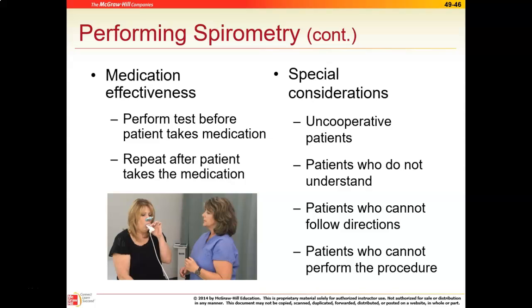Because even if they understand, sometimes it's difficult to perform. And so you can have uncooperative patients, whether intentionally or unintentionally uncooperative. They may not understand what you're talking about. They might struggle to follow directions, and they may be just unable to perform the procedure. So the more coaching, the more communication, the more direction you give and demonstration will help ensure that the patients can perform an accurate test.